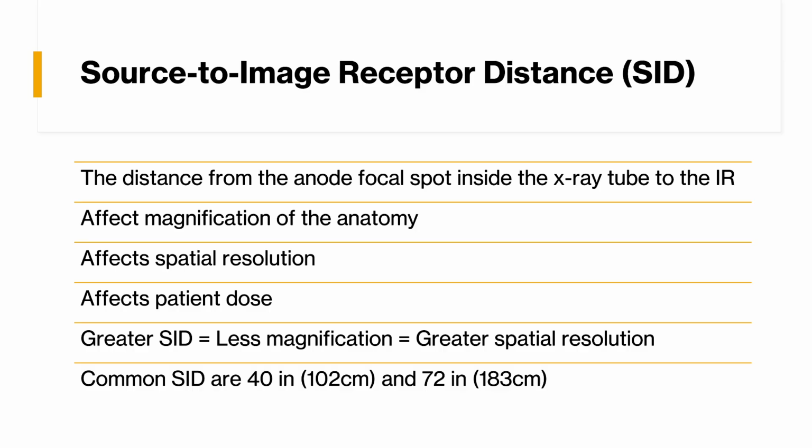Something you'll hear me say a lot is the SID, the source to image receptor distance.